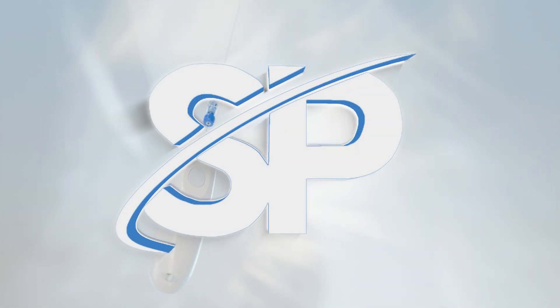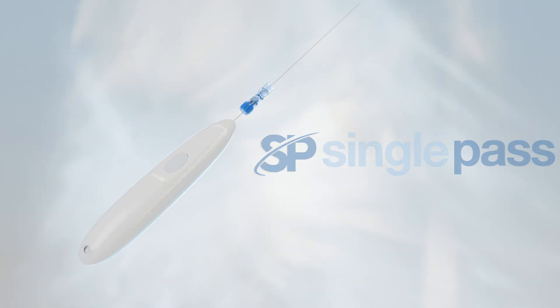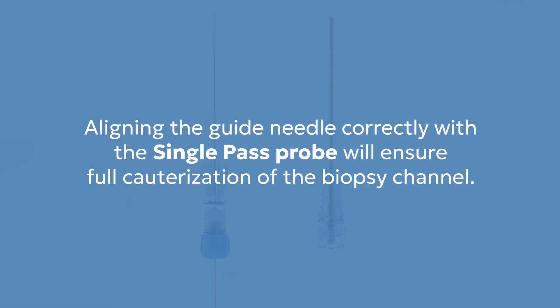The Single Pass Cautery Biopsy Closure Device is designed to cauterize the needle channel following a biopsy. Each procedure begins by properly aligning the selected guide needle with the Single Pass device. Aligning the guide needle correctly with the Single Pass probe will ensure full cauterization of the biopsy channel.